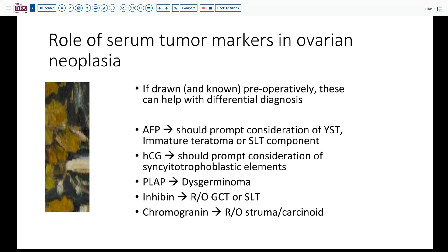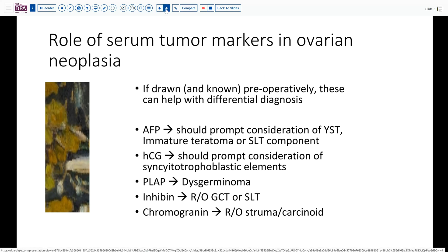AFP can be expressed in yolk sac tumors, immature teratomas, or any Sertoli-Leydig component. HCG — we should be looking for potentially syncytiotrophoblast, either in dysgerminoma or in a choriocarcinoma. PLAP of course is a marker for dysgerminoma. Inhibin for any of our sex cord stromal tumors — granulosa cell or Sertoli-Leydig. And chromogranin in the case of potential teratoma or struma carcinoid.